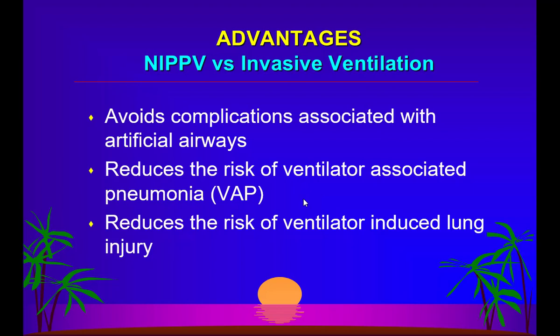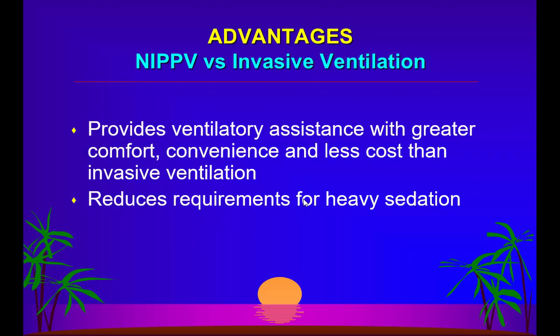So please do not drag these patients on non-invasive ventilation, especially patients of ARDS that I am talking to you. Because it causes more stretching of the lungs and more lung injury. So appropriate timing has to be there. If the non-invasive ventilation, particularly in patients of ARDS, is failing, or the patient is not improving over a sufficient period of time, they should be intubated, ventilated early rather than dragging on the non-invasive ventilation.